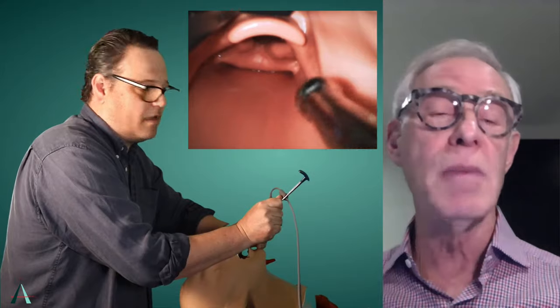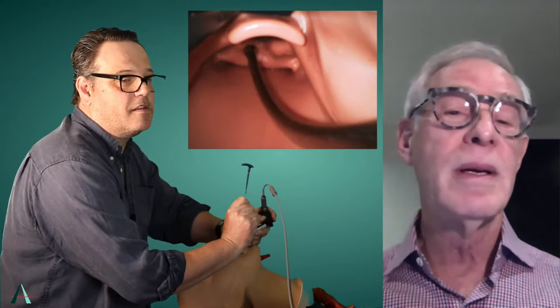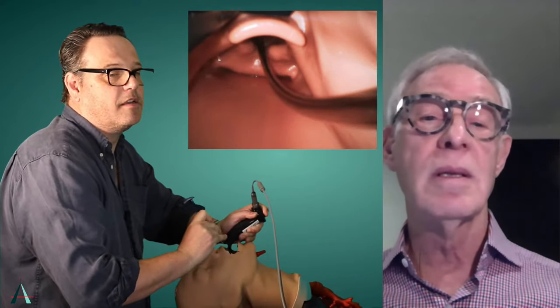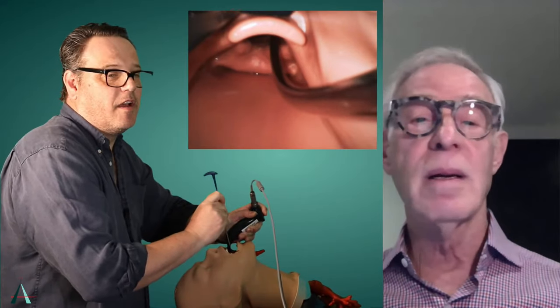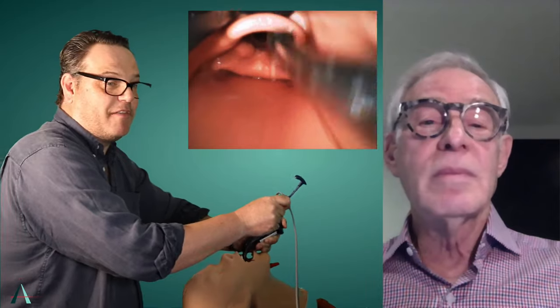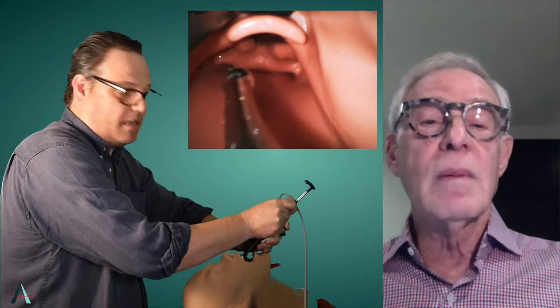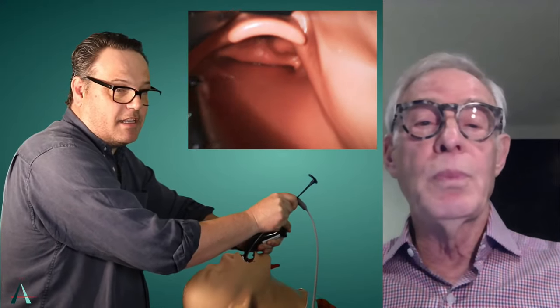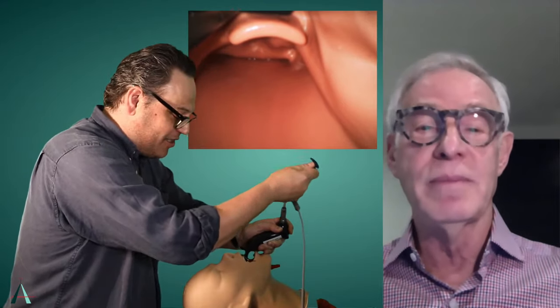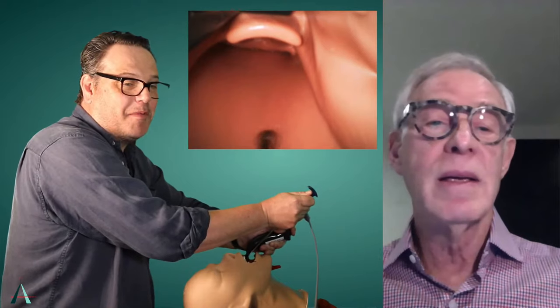Okay, now with the right hand, just slight elevation in the center and then elevation. Now you've got to be a little closer to the larynx. Good. Now elevation and tilt. Okay, let's try that again. I'm sort of struggling with everything being on a funny angle here. This definitely demonstrates the advantage of having your screen in front of you, Richard. I've got it off in a weird space and it's giving me problems.